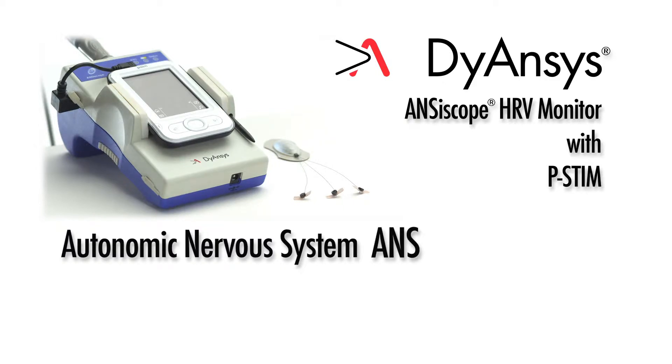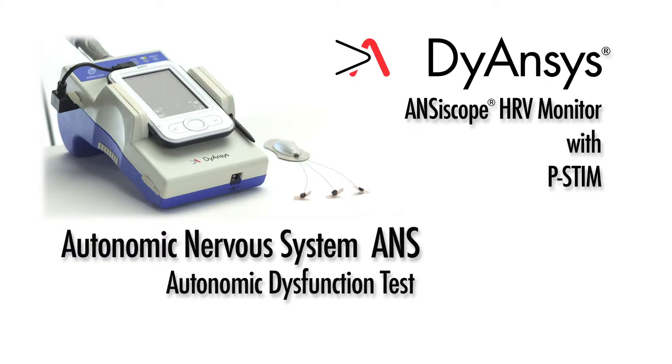The first measurement, the Autonomic Dysfunction Test, establishes the patient baseline ANS reading. The second measurement for sympathovagal balance provides guidance for accurate p-STEM needle placement and treatment monitoring.